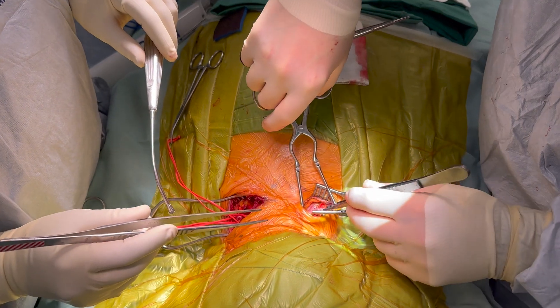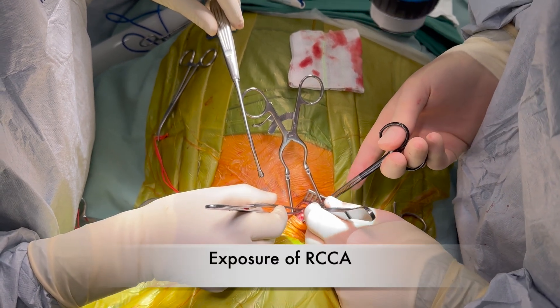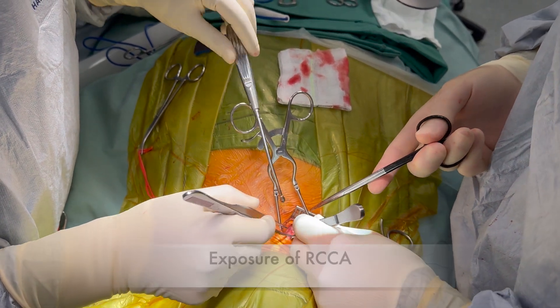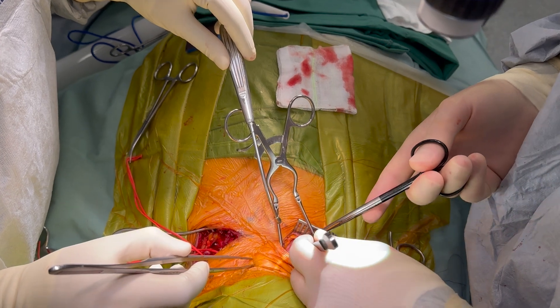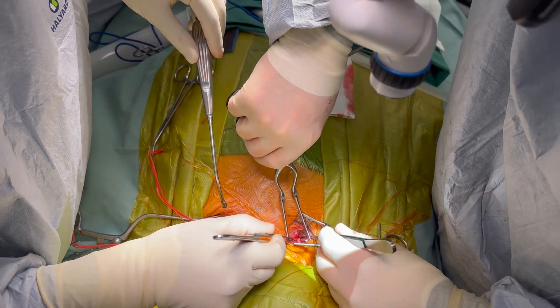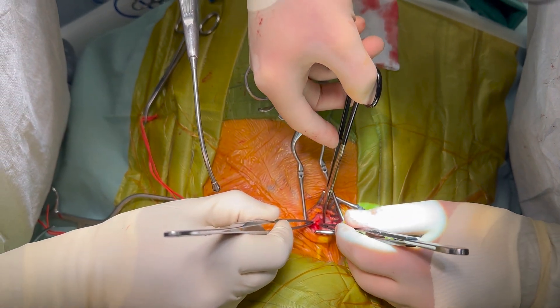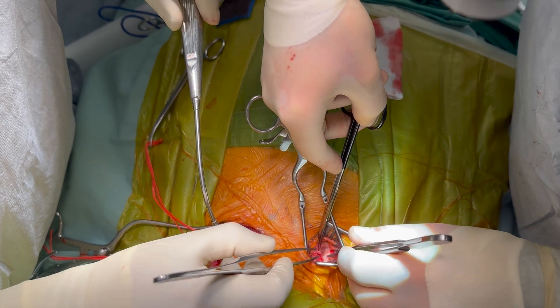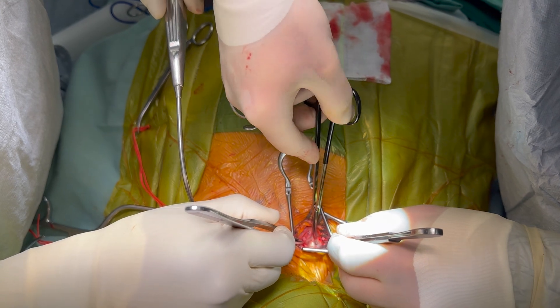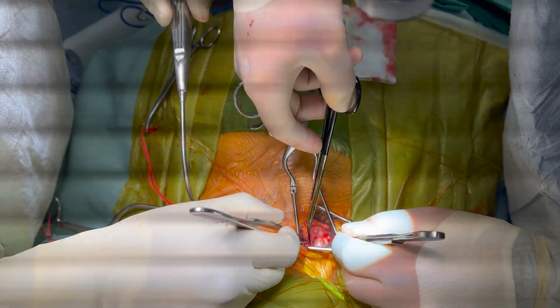Through a very small incision in the base of the right neck, over the division of the heads of the sternomastoid into the clavicular and sternal parts, we've come onto the internal jugular vein. We've divided a couple of tributaries to retract it laterally and posteriorly. Once we've done that, we have pretty good access to the carotid artery, which you can just see coming into view. Once we're in the carotid sheath, we have to keep in mind the vagus nerve, which we haven't seen but are keeping watch for.